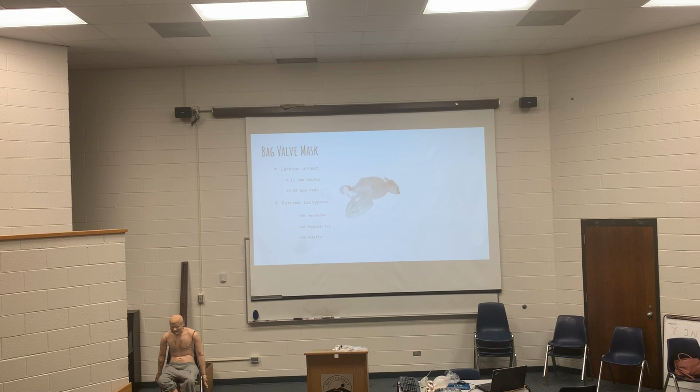So bag valve masks is for people who need assistance, whether it be too fast, too slow, or not at all. Some people that might need it are, of course, cardiac arrest patients. We've talked about that.